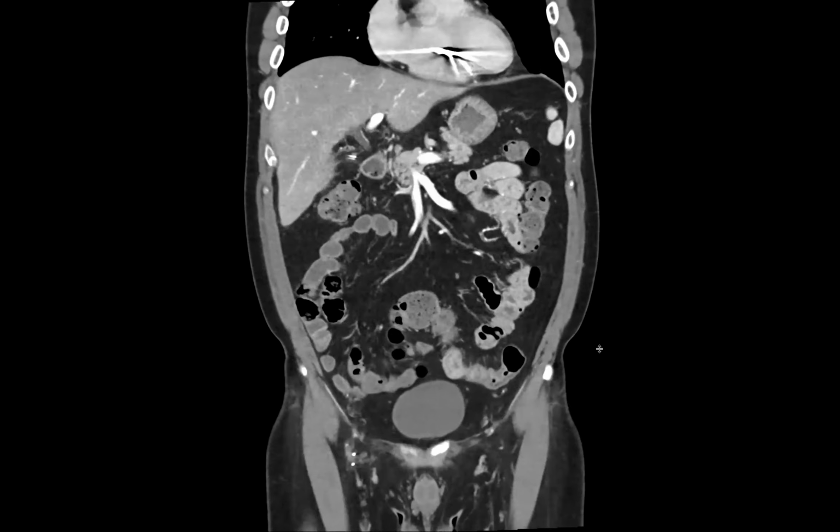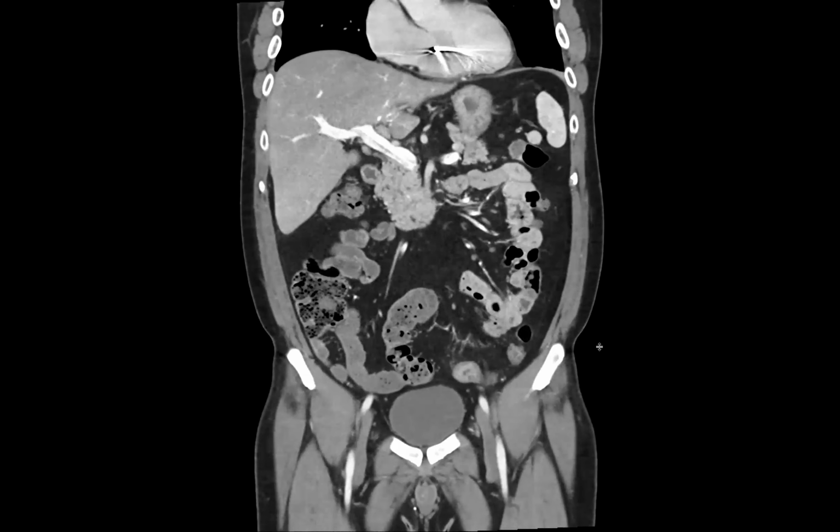Nelly, is the portal vein just volume averaging? Will you window? Oh, yes. Portal vein is patent. Okay. And it is volume averaging. We have a subsequent CT that shows that.